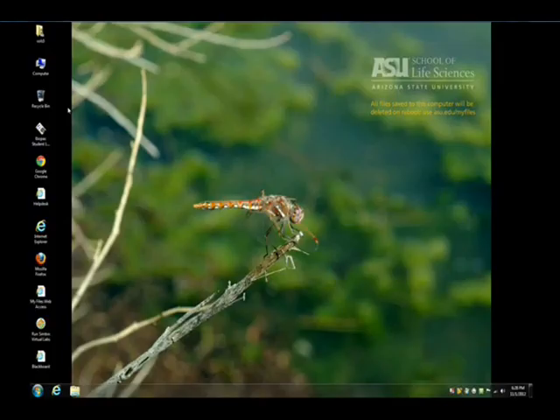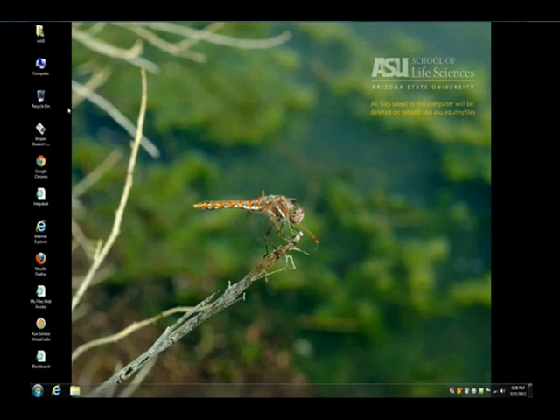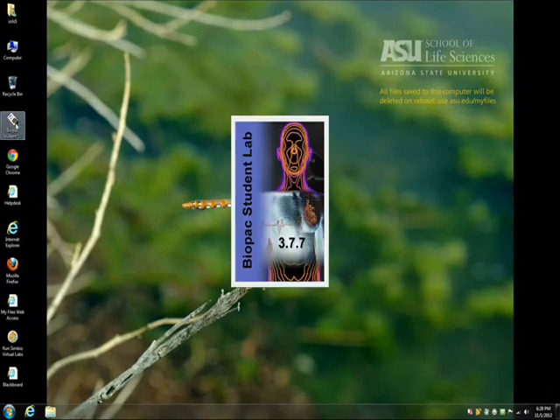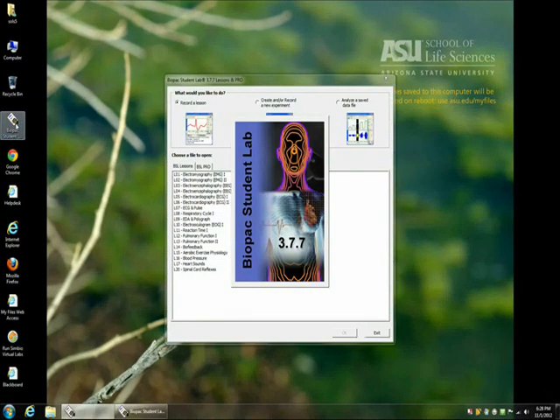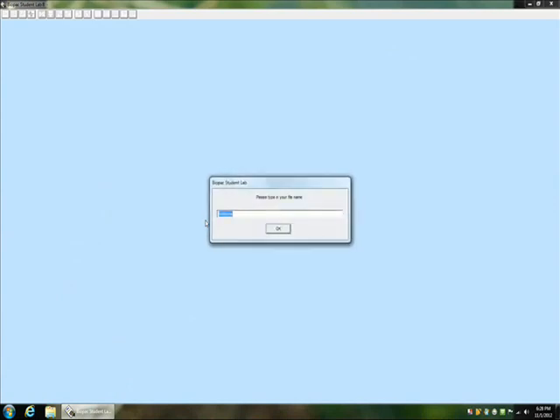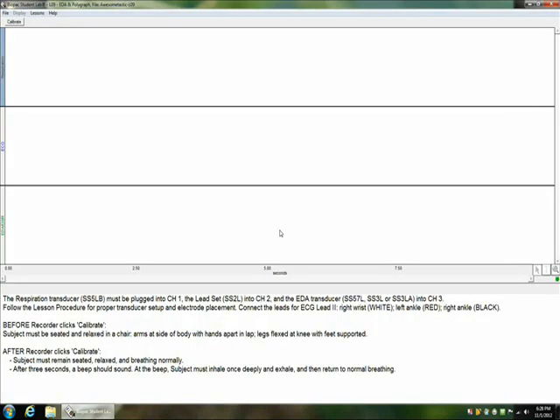Now that your subject is all set up, they can go ahead, relax, and take a seat near the equipment. Anywhere works, but just be sure they can't see the computer screen as this may skew your results later. So once they've done this, the recorder can jump on the computer, open up the Biopac Labs icon on the desktop, and then click the EDA and Polygraph Lab. You'll then be asked to name your file. Any name works. And once we do that, we're going to click OK and we'll be taken to the calibration screen.